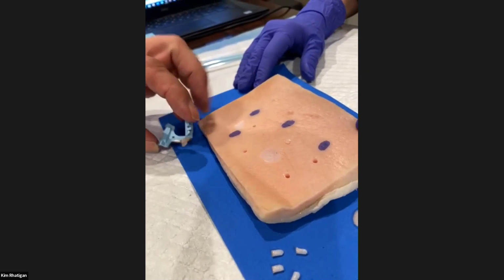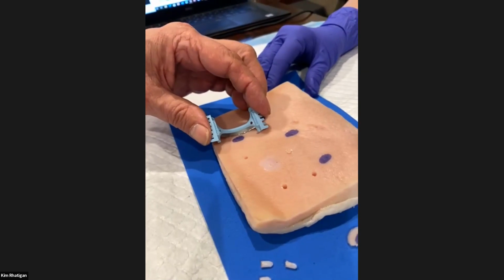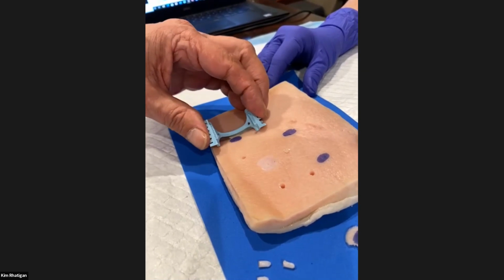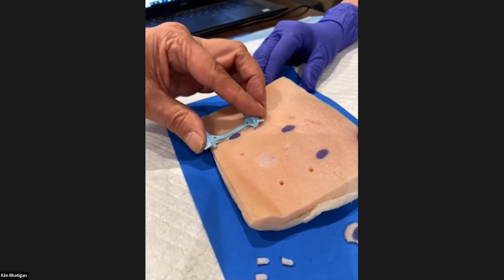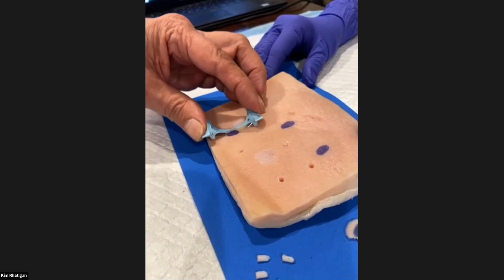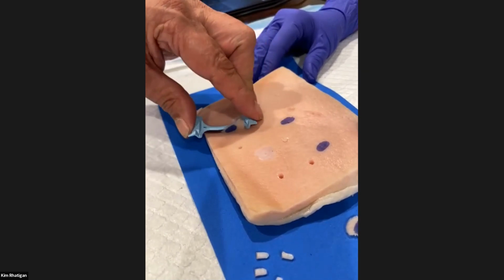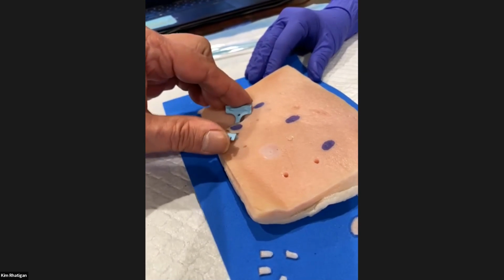Do you want to demonstrate? So you'll come in at a high angle, start outside the lesion. You'll rock back and forth. Then once you're in, you can actually flatten the blade out. Oh, that's beautiful. And you can come around and cut it off from this side.